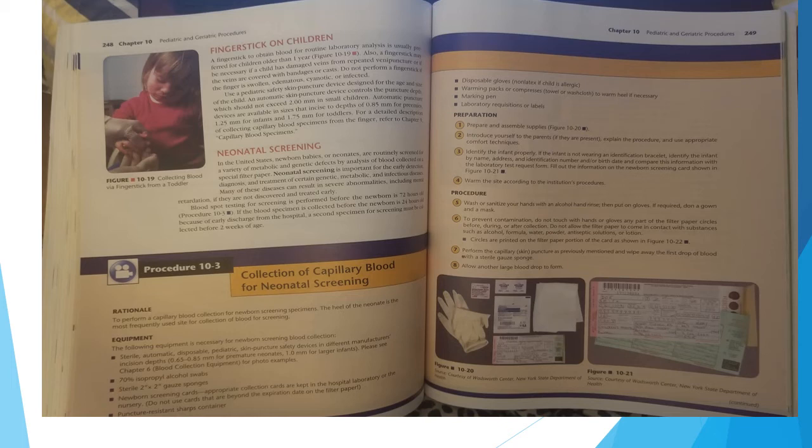Preparation: prepare and assemble supplies. Introduce yourself to the parents if they are present. Explain the procedure and use appropriate comfort techniques. Identify the infant properly. If the infant is not wearing an identification bracelet, identify the infant by name, address, and identification number and/or birth date, and compare this information with the laboratory test request form. Fill out the information on the newborn screening card shown in Figure 1021. Warm the site according to the institution's procedures.